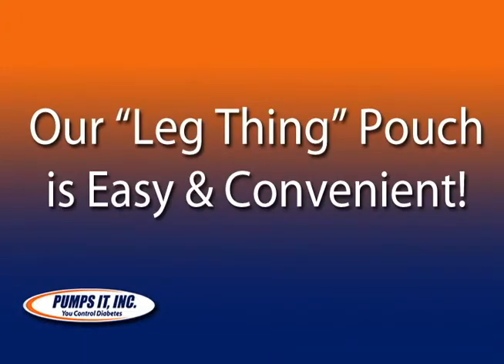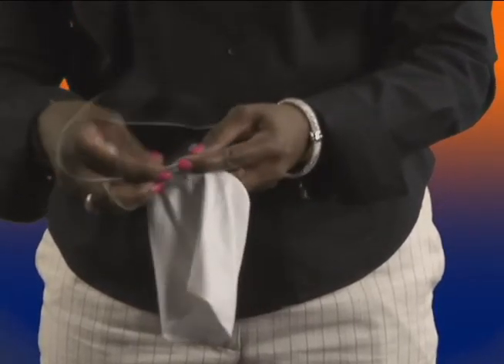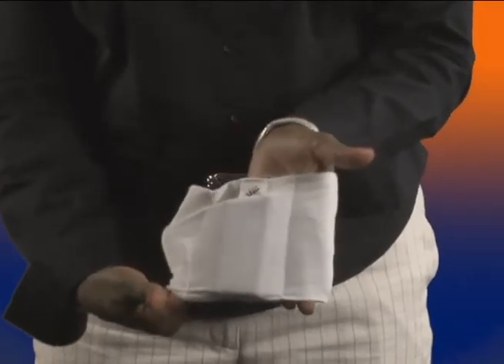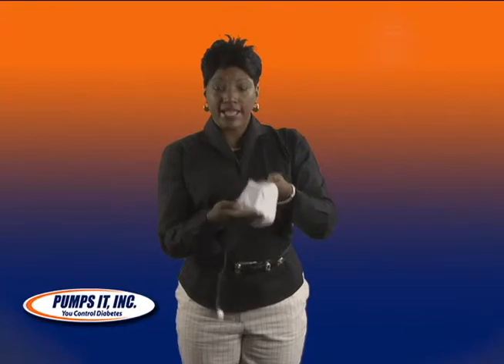A lot of gentlemen like to wear theirs this way. The last thing I want to show you is called the leg thing, and it's nothing more than an elastic band. It has a built-in secret pouch with a velcro closure. Your pump slides down in it. You close the velcro and this can be used on your leg or on your forearm. It keeps the pump secure and in place.